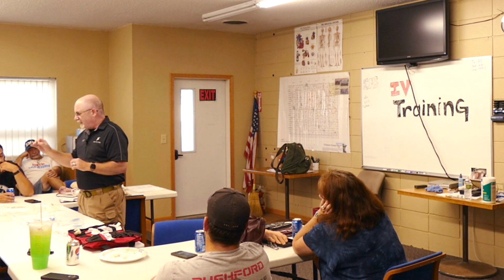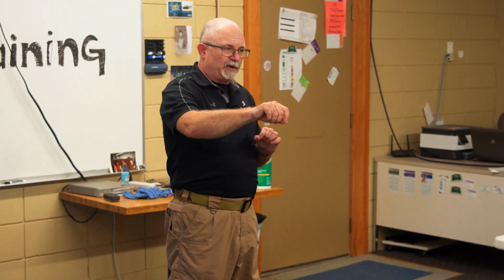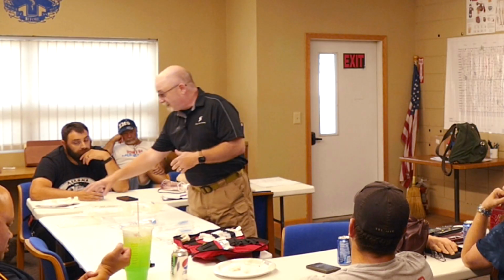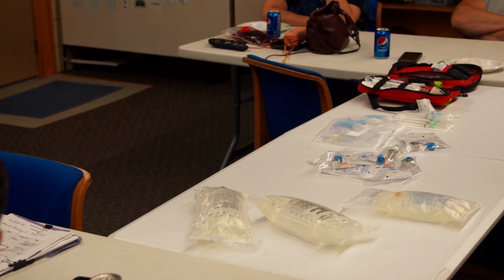The way we're getting away with it in Minnesota by letting EMTs do an intravenous medication is, it's at a point where the docs have all agreed it's still a solution. Usually D5 is about as far as that goes, but D10 we're allowed to do. So this is as much sugar as anybody has been around to seeing the medics or the hospital do with D50, that big old thing. It's the same amount of the drug, it's just in a more diluted solution.